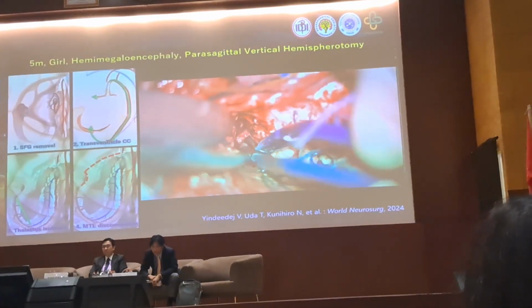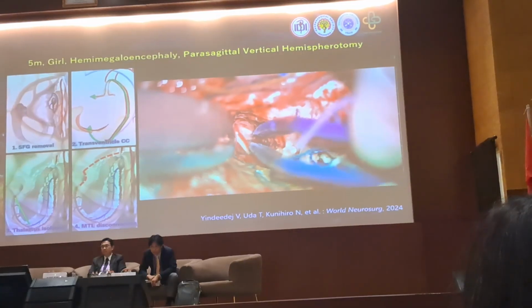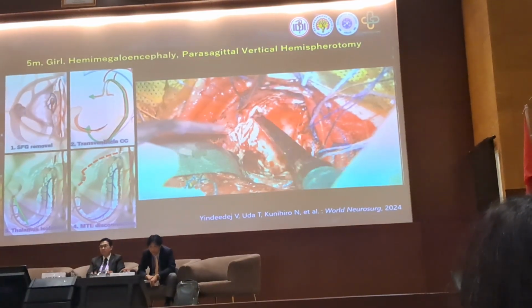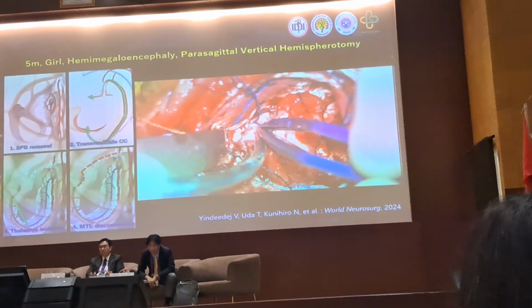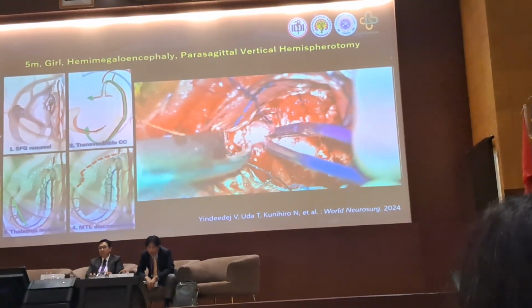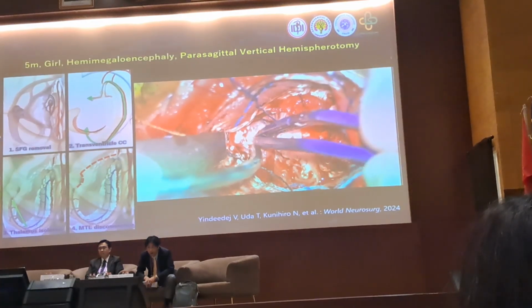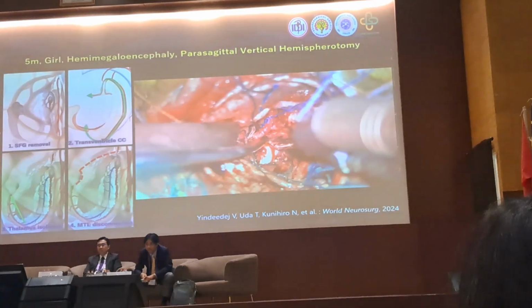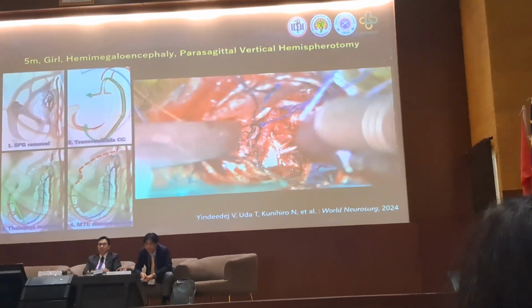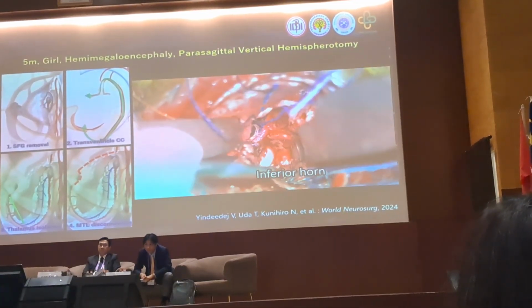And go forward to the inferior horn of the lateral ventricle. And we reached the inferior horn of the lateral ventricle and confirmed the hippocampus.